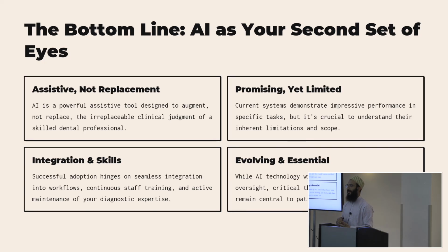And so I think Pearl still has it. I don't know if it does. But we added a feature that if Pearl's not going to catch it all the time, if Pearl didn't catch it, you can just draw a box saying that it's there. It just helps you explain things a little bit. Do you guys ever do study on acceptance with or without AI?